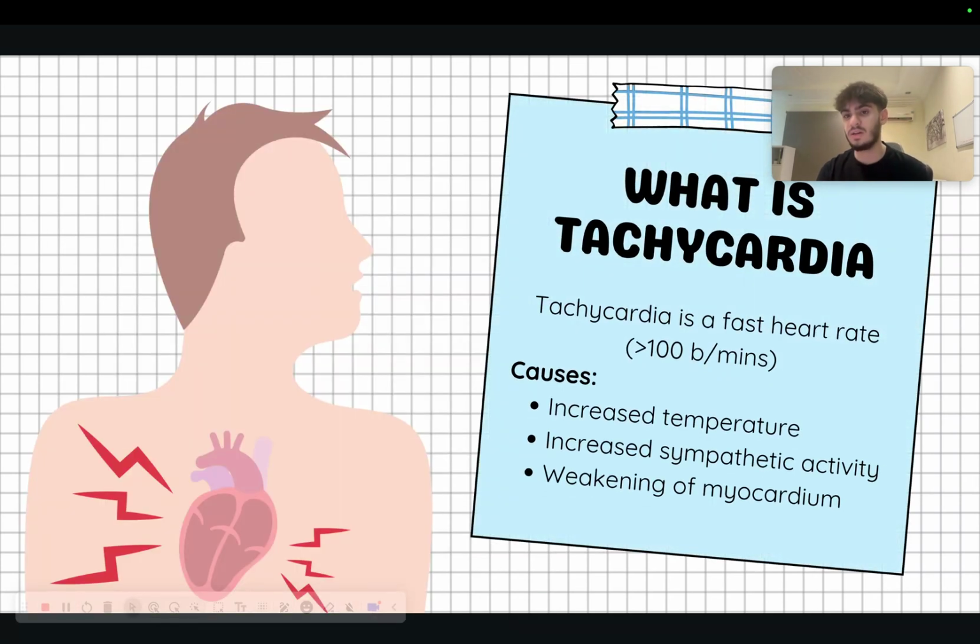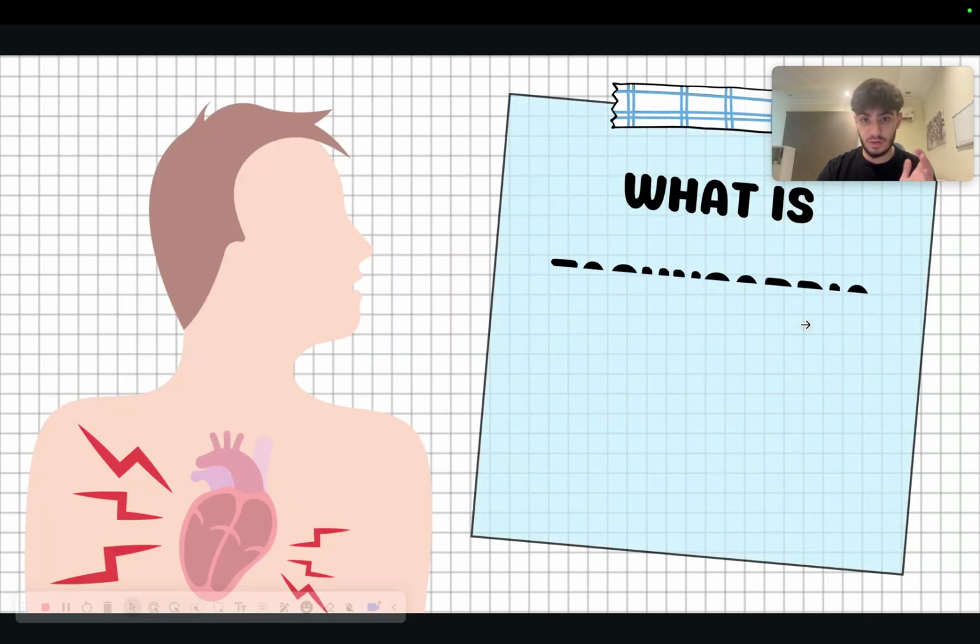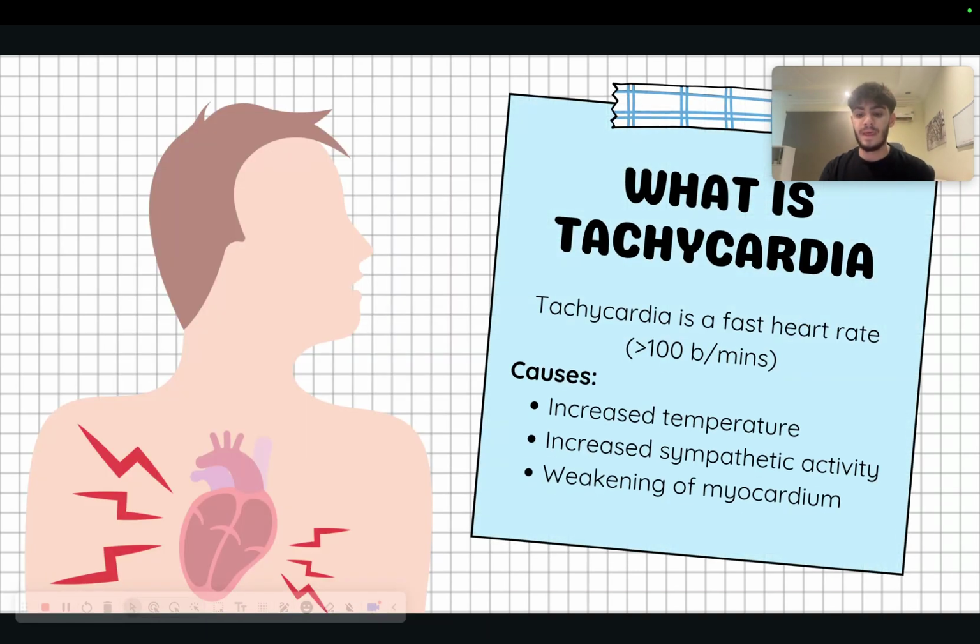Now, the first cardiac arrhythmia we're going to talk about is tachycardia. So what is tachycardia? Tachycardia is when your heart rhythm, your heart beating, is quick, is beating multiple times repetitively. Your R waves, as we mentioned over here, are going to be closer. And we're also going to see a picture later on. But now let's talk about the three causes of tachycardia.